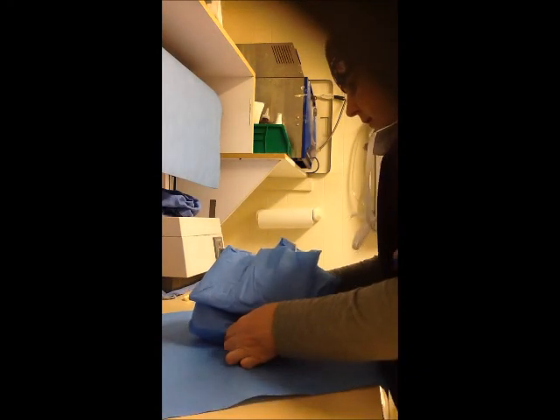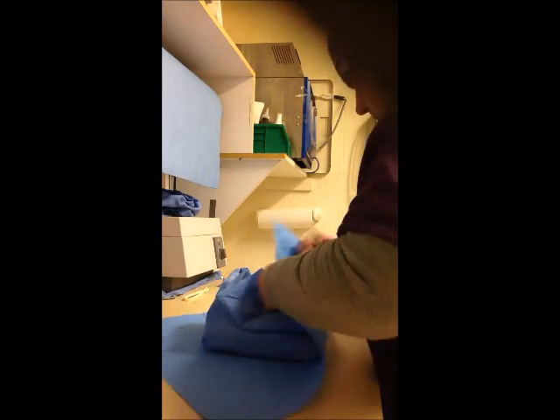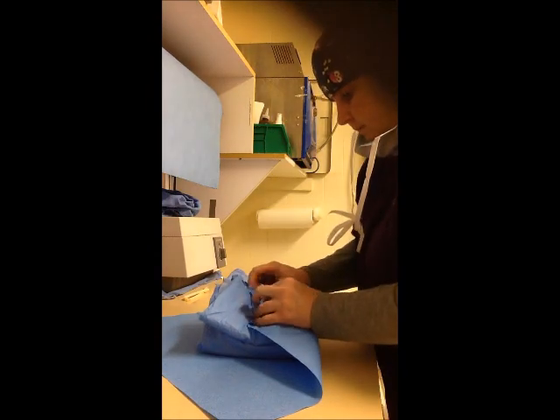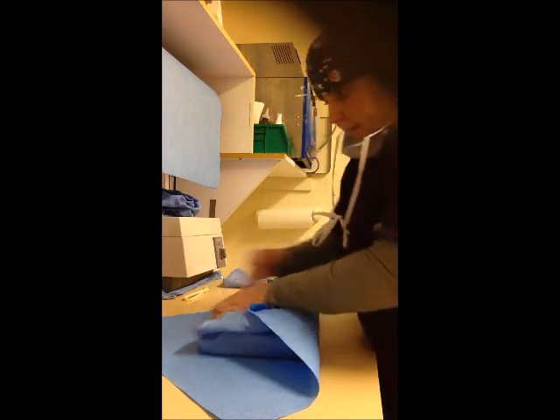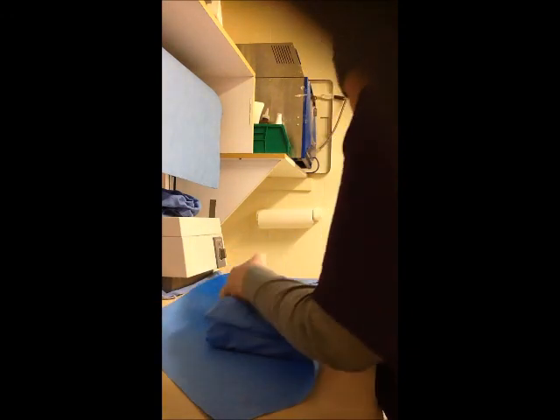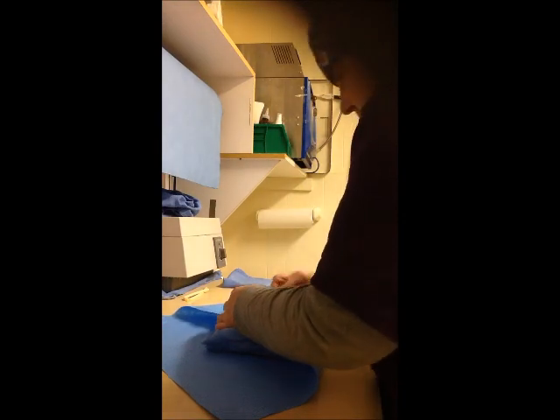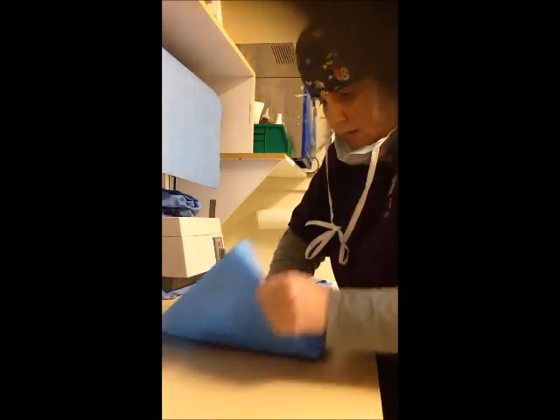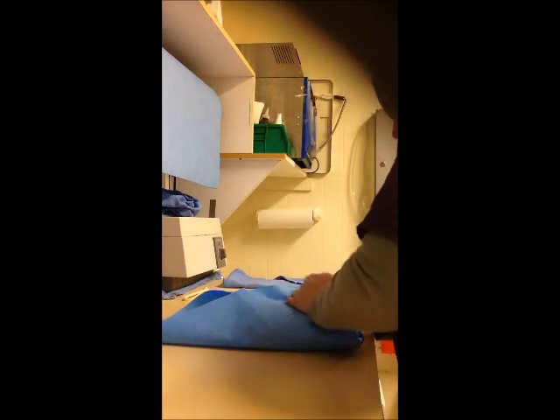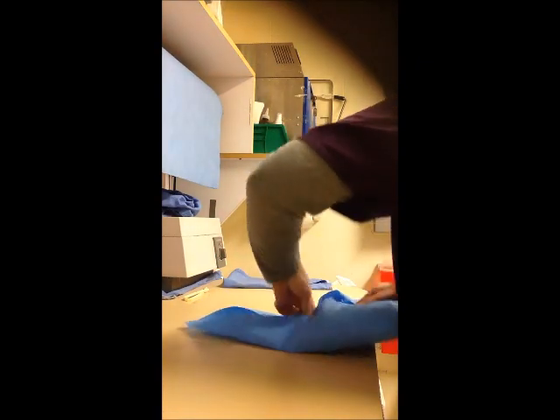Okay, so what I gotta do. So really a little tab up here, to do the same thing. An accordion, we have a little tab up there. Accordion. Up here, and then I pull these 2 taut.